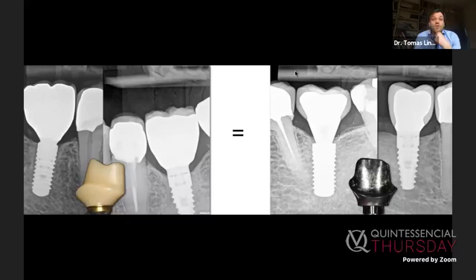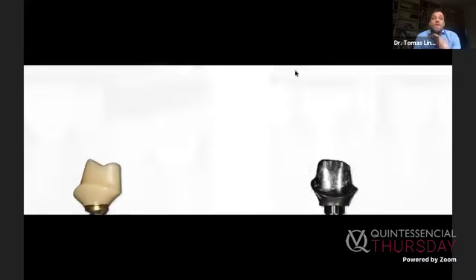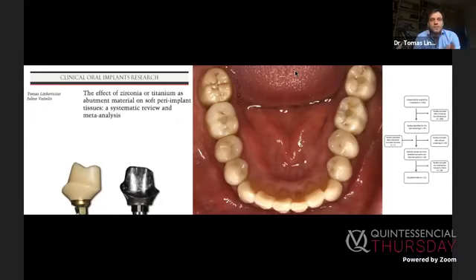Now, of course, you cannot find a study which says that if you use zirconia abutments, your implants will last longer compared to, let's say, titanium abutments. We're not talking about survival or success of the implants. However, I think we have already passed this threshold, when we think that implants are integrated and we take it as a norm. What we must now discuss is what material really influences the tissues.